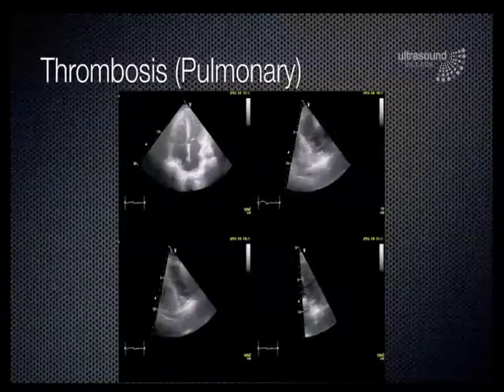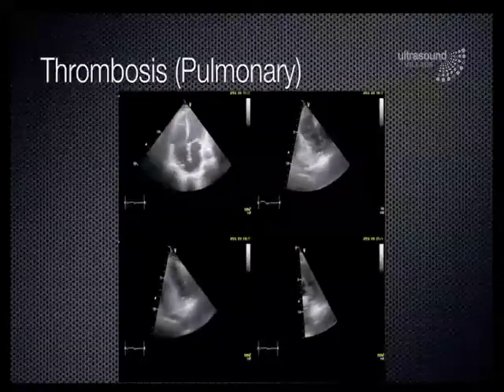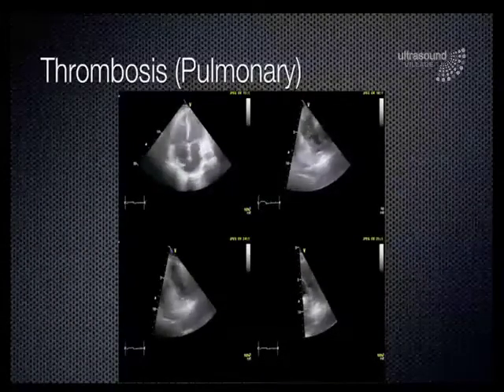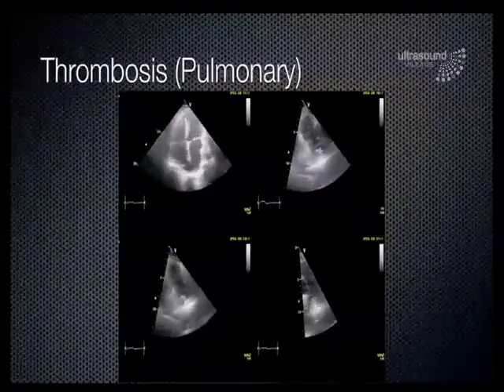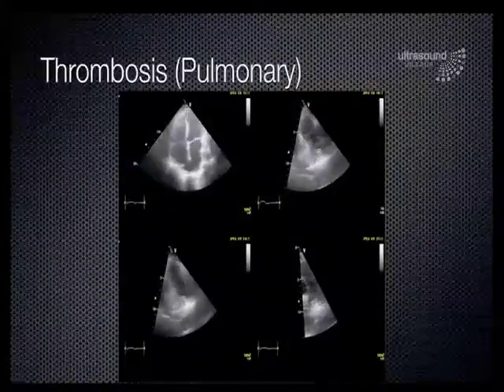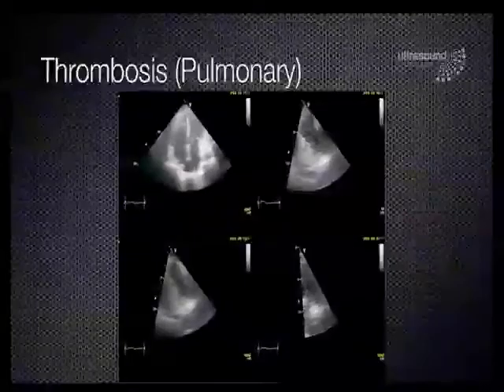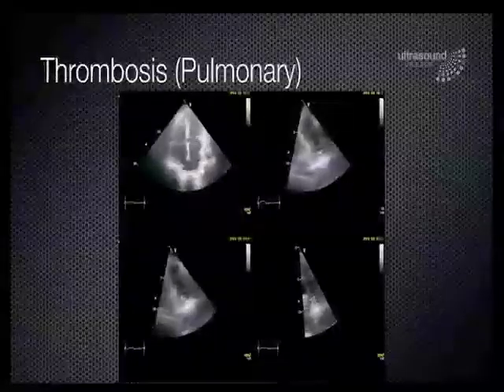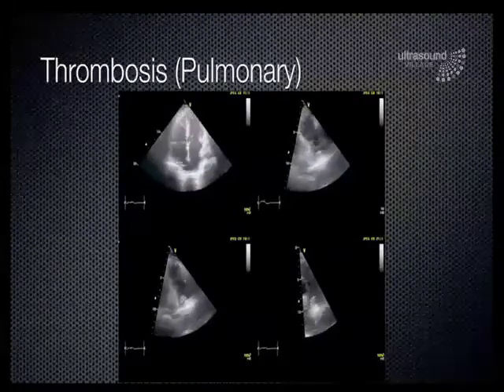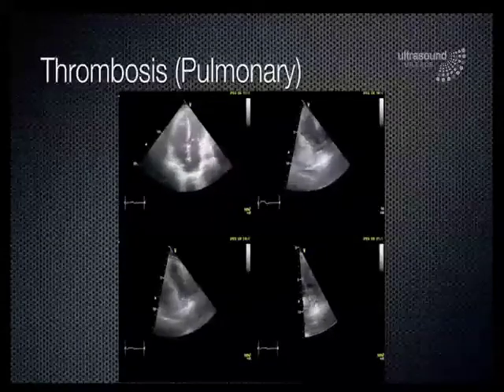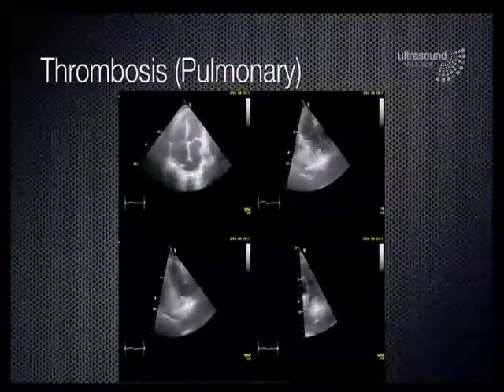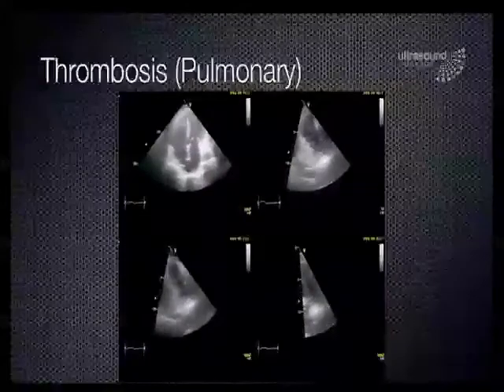In this 4-up display, one can see a dilated right ventricle — the same size if not slightly bigger than the left ventricle in the apical four-chamber view — and there's the impression of something flicking in the right atrium. The views at the right top and left bottom are of the pulmonary artery and its bifurcation, showing a mobile clot at the bifurcation.